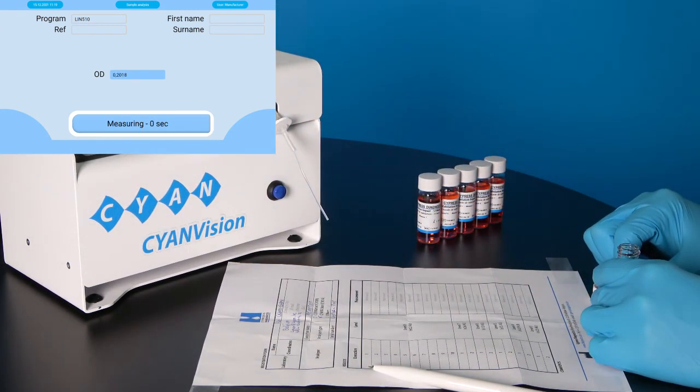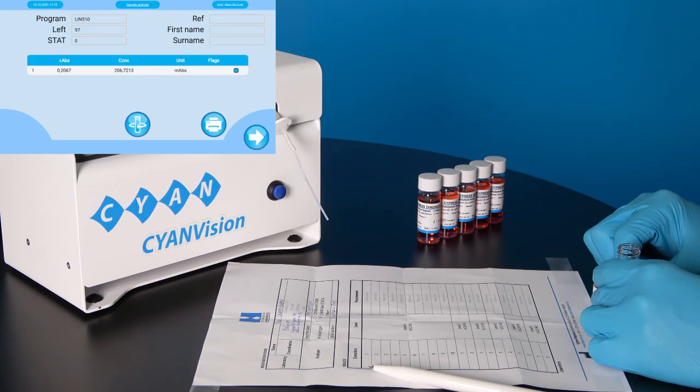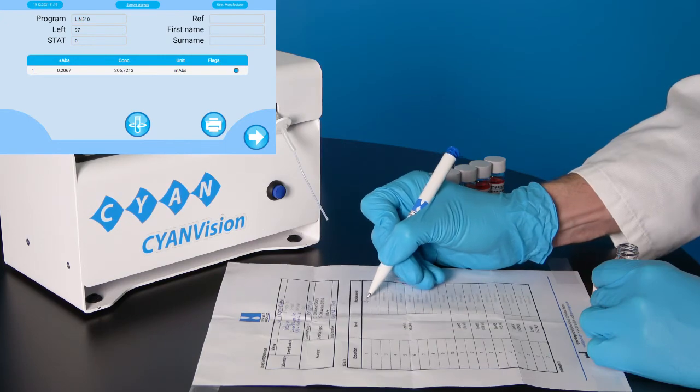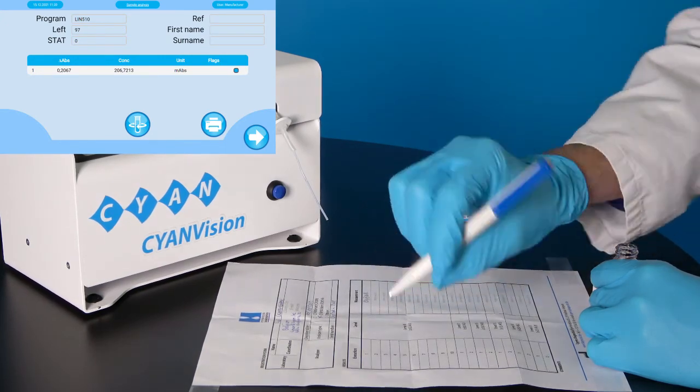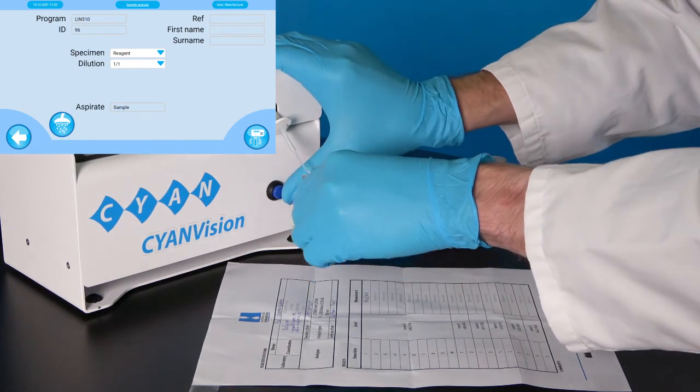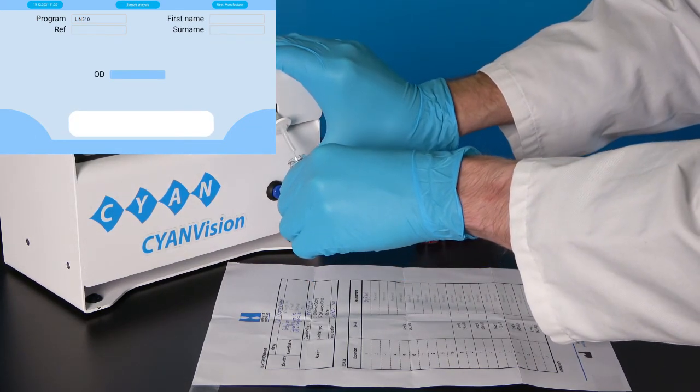After aspiration and measurement, note down the result on the included form. We repeat this action 9 additional times until we have 10 executions of level 8.